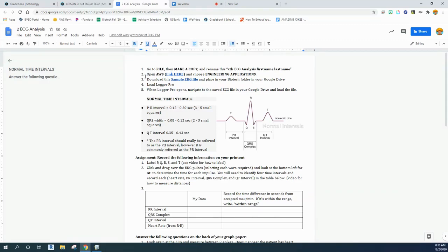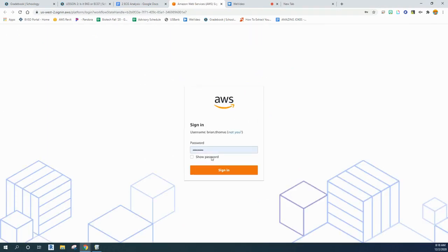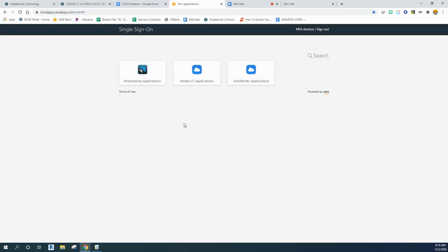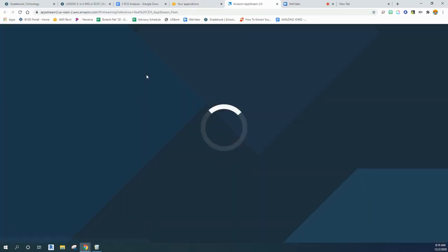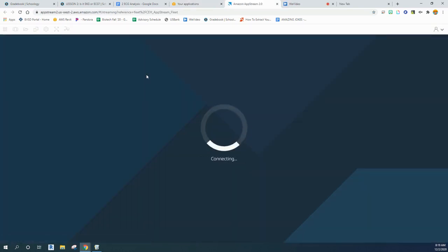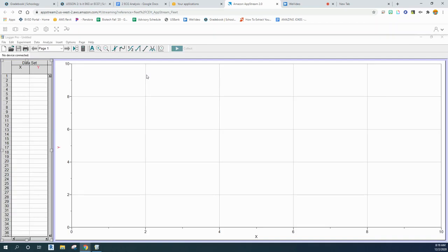If you're having a hard time getting the file to load, just follow along here. First, log into Amazon Web Services, select Engineering Applications, and then choose Logger Pro. Mine was already preloaded for some weird reason.